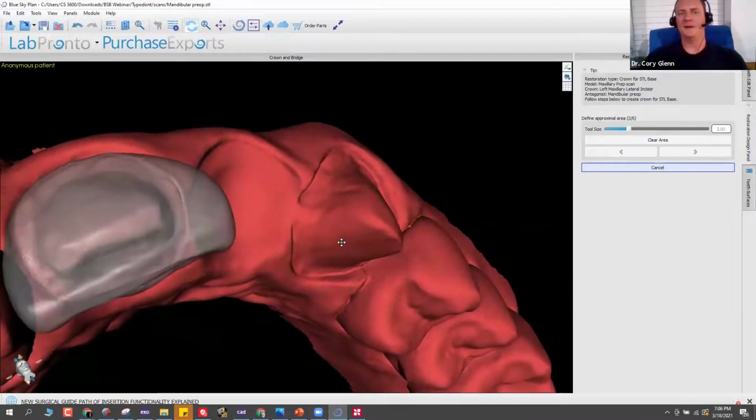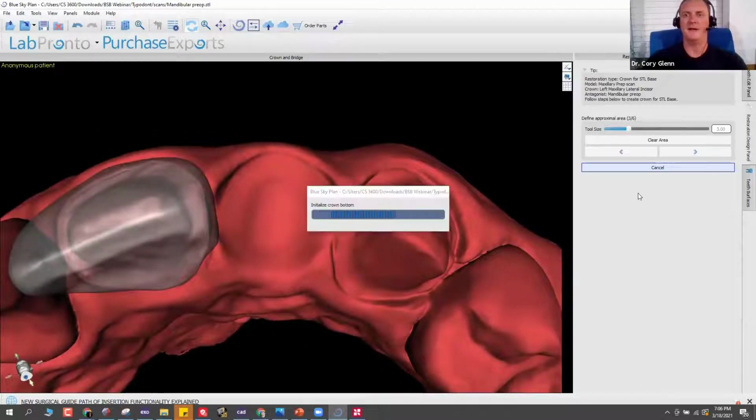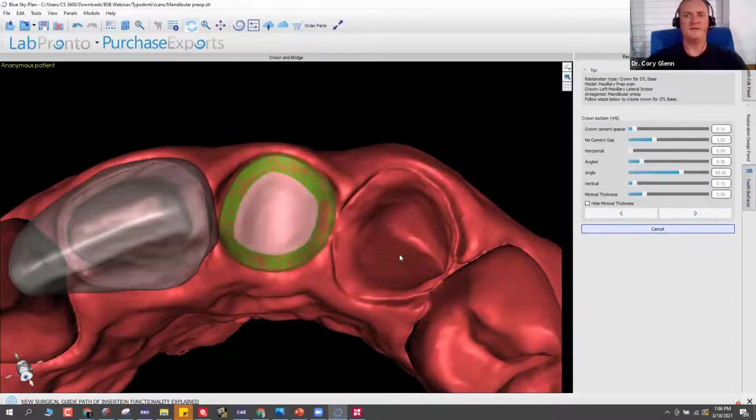I just don't know what it is off the top of my head, so you might have to pull up the insert for that. Again, the resin I'm speaking of, the only one that's approved in the US right now that I'm aware of, is made by Bego, B-E-G-O, and it's called Varseo Crown. So you can very easily go online and look at any kind of packets that they have for that.